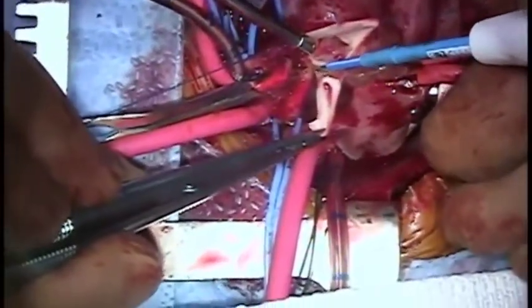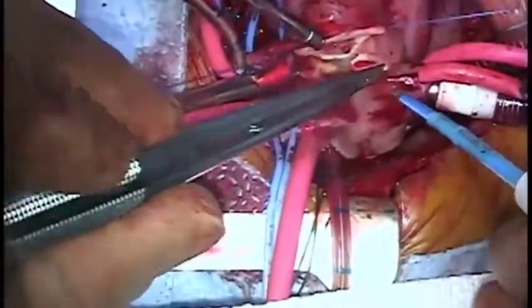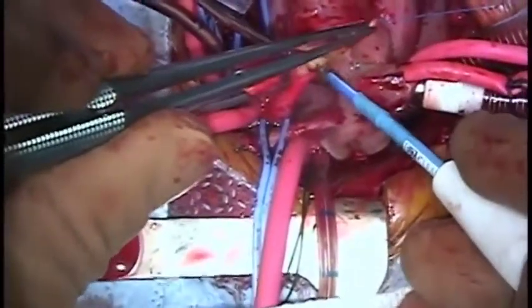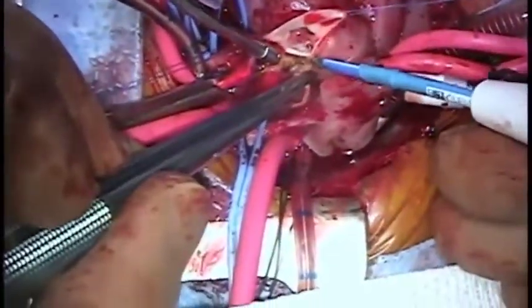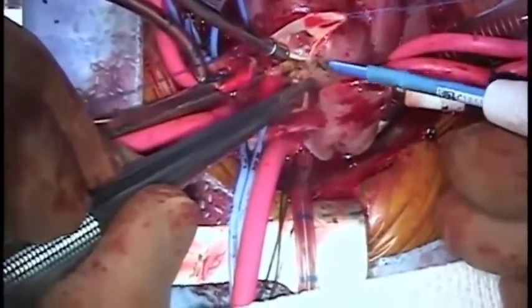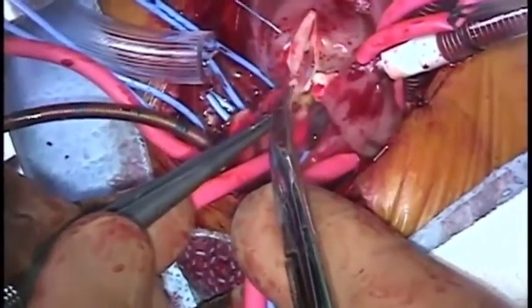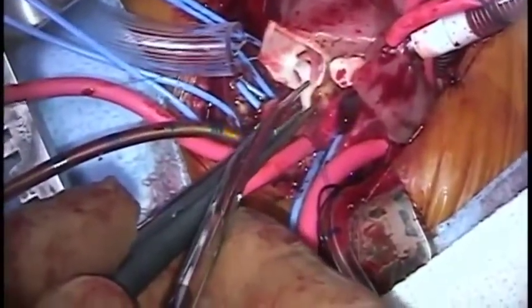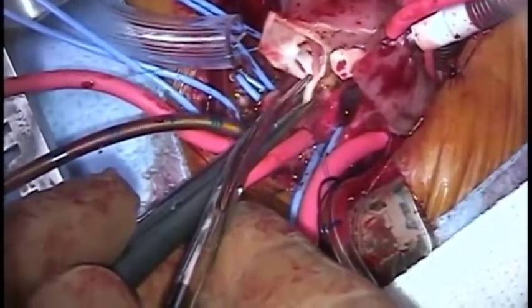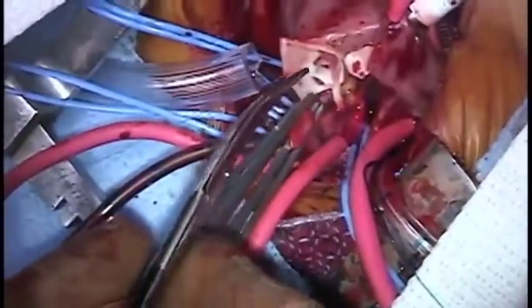It is essential to fully mobilise the coronary and neopulmonary artery from all epicardial attachments. Here the sinus node artery can be seen crossing the roof of the right atrium. Division of these epicardial attachments is important in order to prevent kinking and twisting after the reconstructed great vessels are filled with blood. The left coronary artery is mobilized in an identical fashion. To the left of the picture, the CO2 insufflation tubing can be seen. This is used to reduce the risk of air embolus.